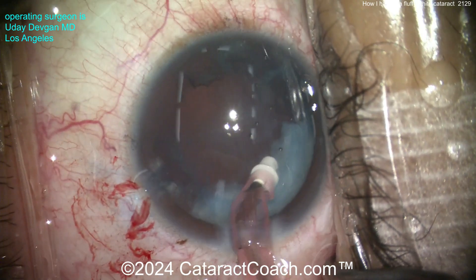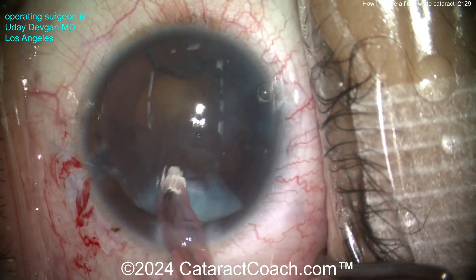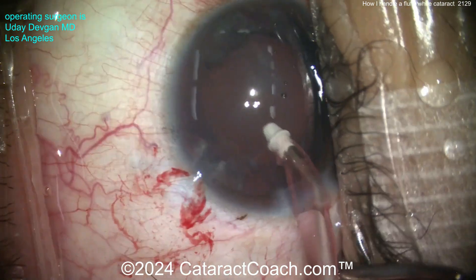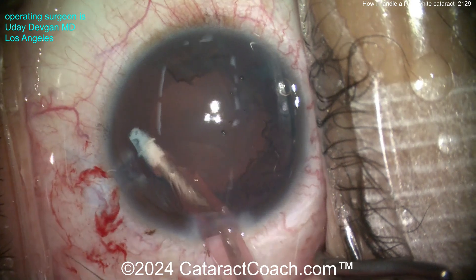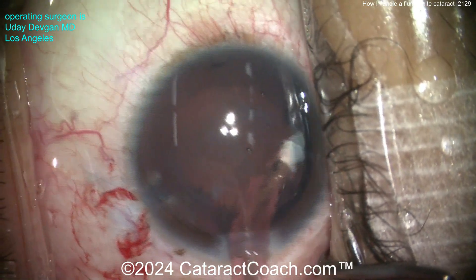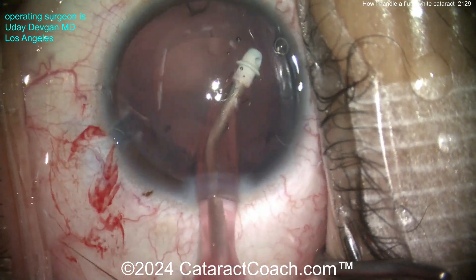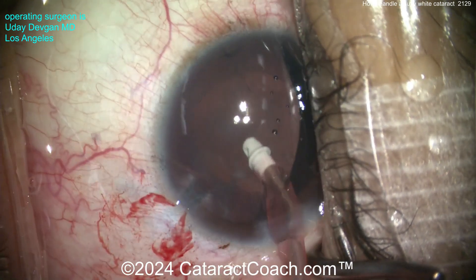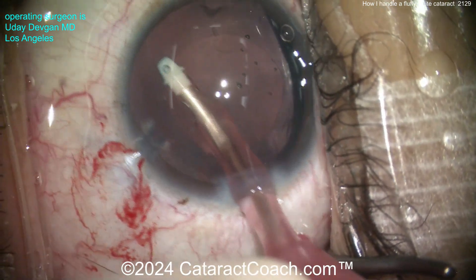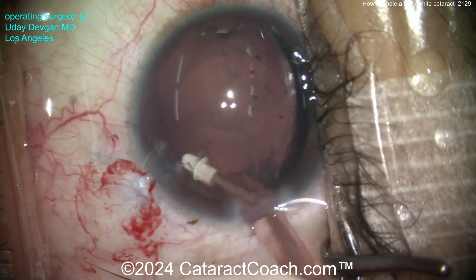You can have a lot of this white lens material adherent to the bag, so I'm being cautious and looking around for any other signs of trauma. In an eye like this, you want to make sure — is there any zonulopathy? Are there any iris defects? Is the capsule okay? Everything looks pretty darn good, and I'm trying to clean up as much of the lens material as I can.